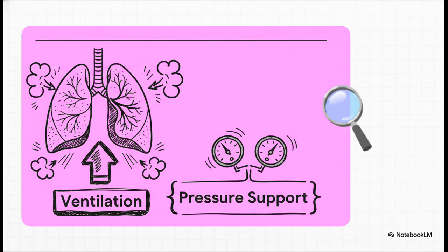The gap between those two pressures, your IPAP minus your EPAP, creates something we call pressure support. And here is the kicker. The bigger your pressure support, the more the machine is physically helping the patient take in larger tidal volumes. By forcing that larger breath, we hit the ventilatory component and successfully clear out all that trapped carbon dioxide.